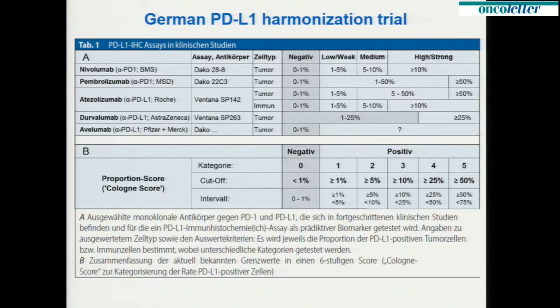So then, in December we had a meeting for a Swiss harmonization trial of PD-L1. I wanted to know how reproducible is what I'm doing here. And I retrieved the very same blocks again, and I repeated the very same IHCs again.